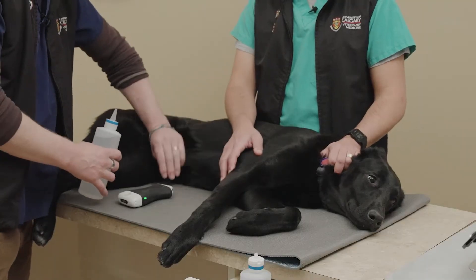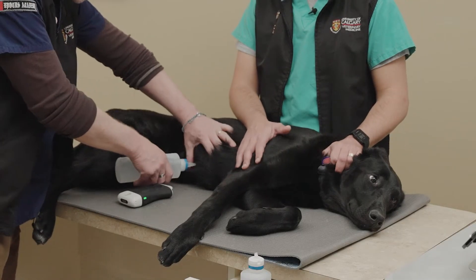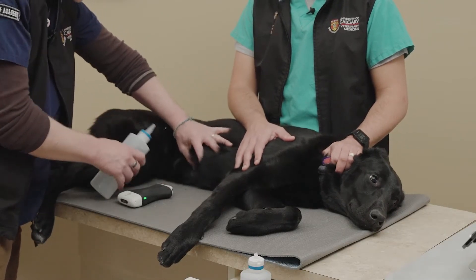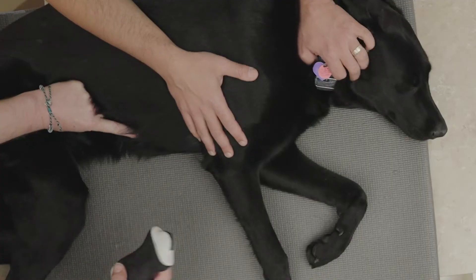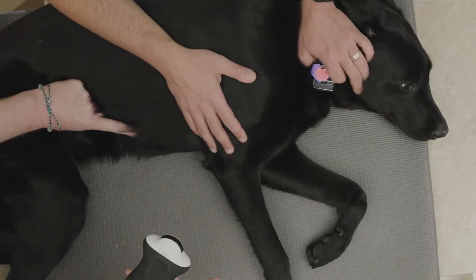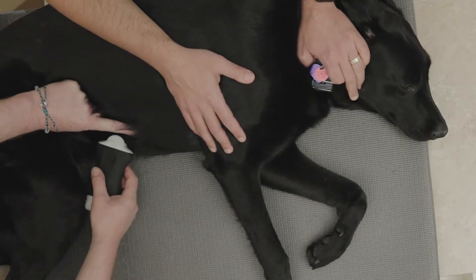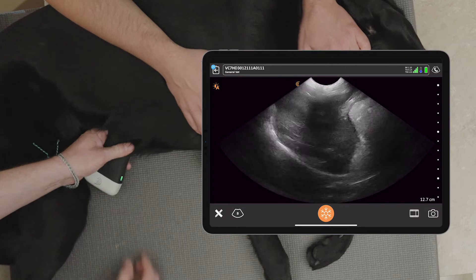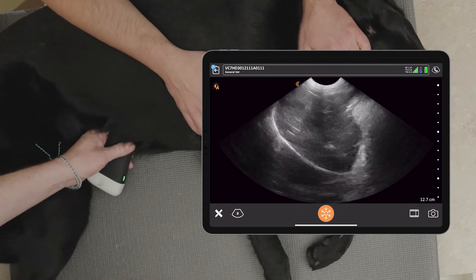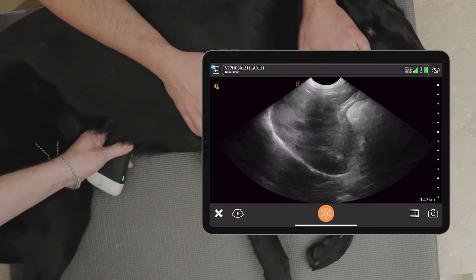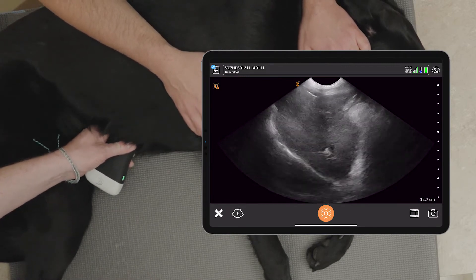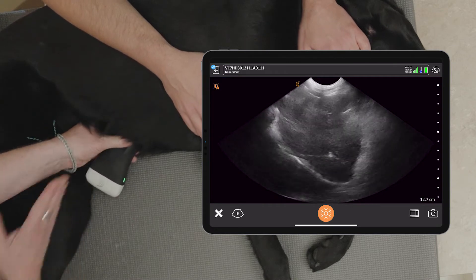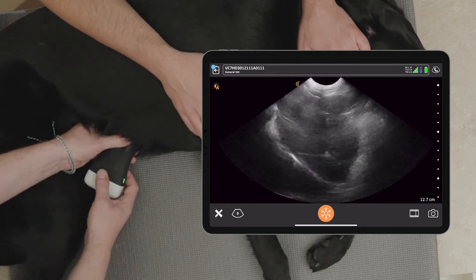We're gonna start with the sub-xiphoid site. Separate the fur so you can see the skin and get good image quality. Marker towards the head, come in and pop the probe in at that sub-xiphoid location. That gives us a nice view — we find it at an angle of about 45 degrees.